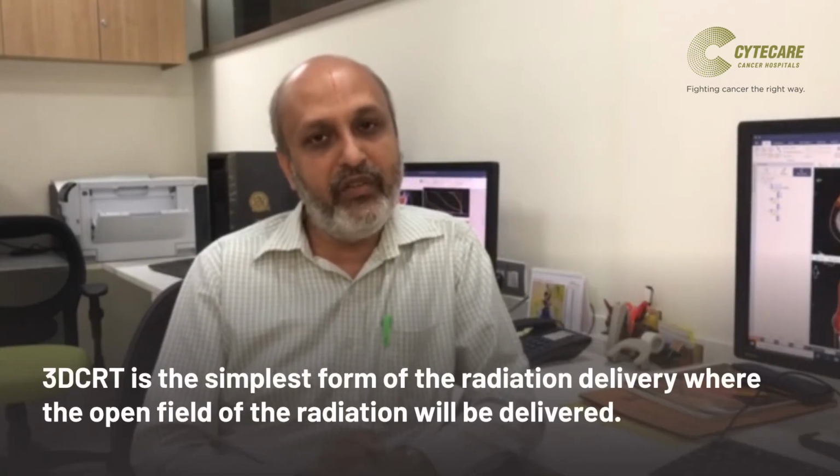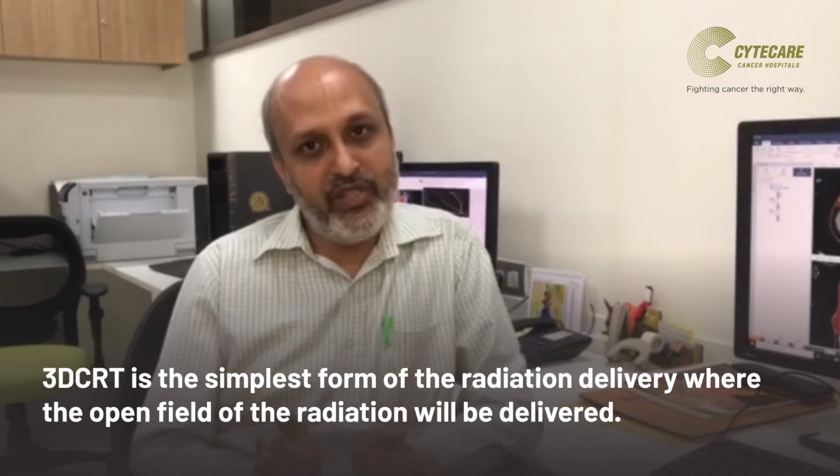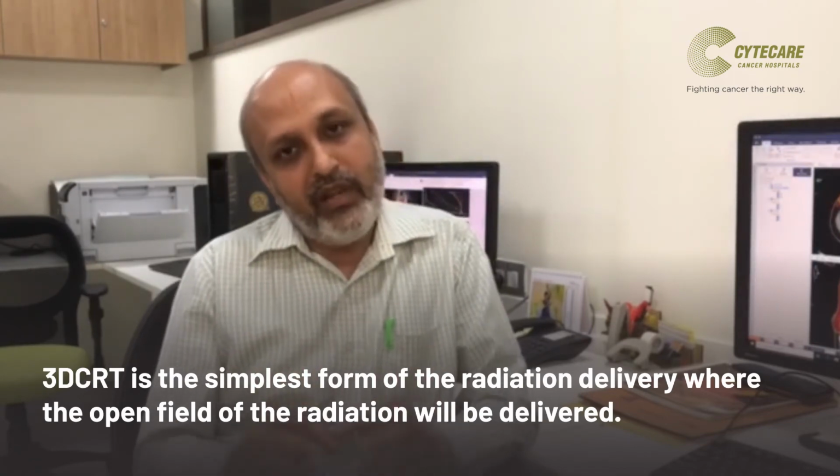3D CRT is the simplest form of radiation delivery, where an open field of radiation is delivered. For example, a square or tumor-shaped radiation field will be opened, and at a particular gantry angle the radiation is delivered on that static field. Once that is over, the next gantry angle is taken, and from there the radiation field is delivered again. The whole radiation dose is summed up, and the target gets more radiation at the center with minimal dose to the critical structures.